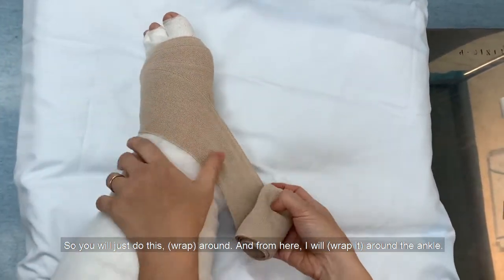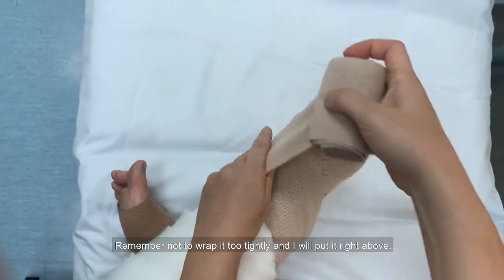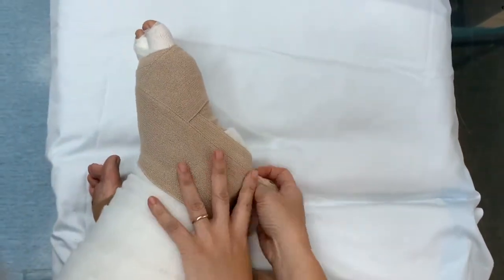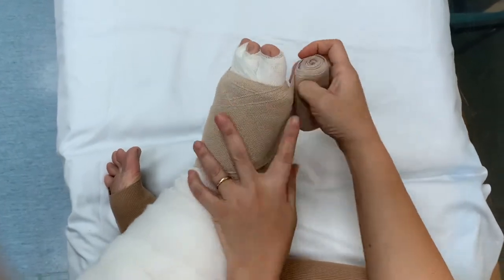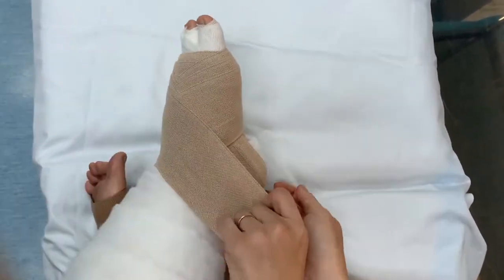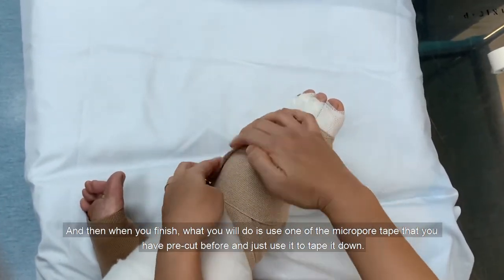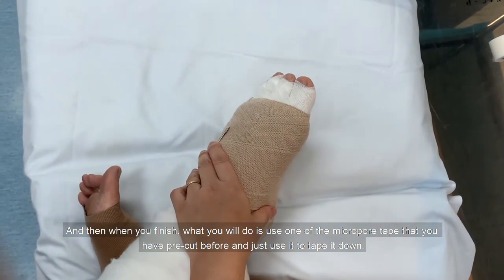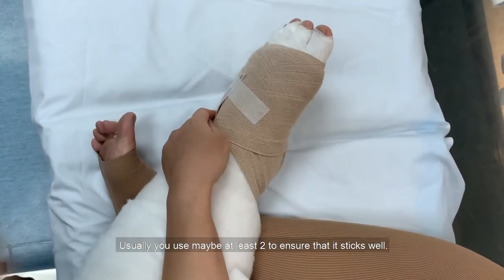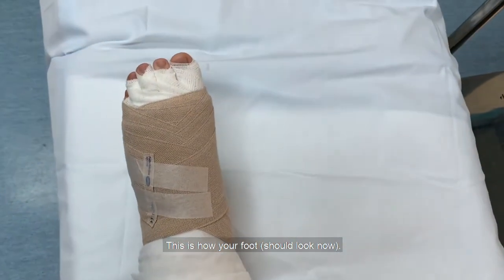Go around the ankle, pull it up — remember not to pull too tightly. When you finish the foot section, use one of the micropore tape strips that you pre-cut and use that to secure it down. Usually use at least two strips to ensure that it sticks well. This completes the bandaging on your foot.